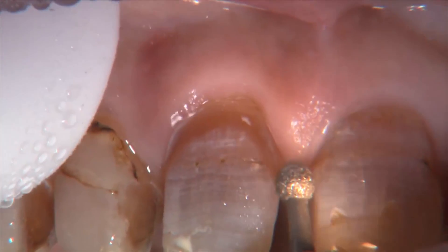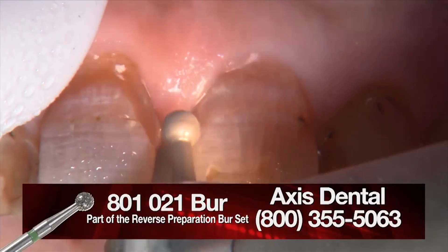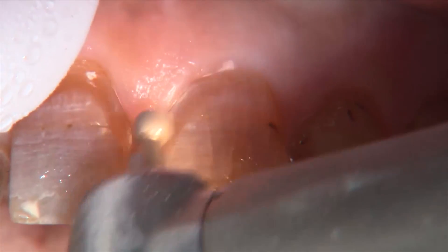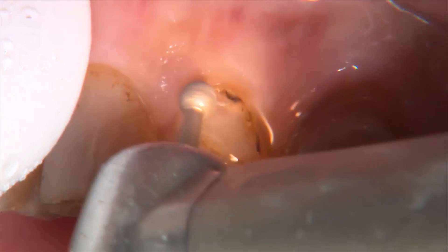Here's one of life's simple pleasures — cutting off a PFM. How wonderful that is compared to cutting off some of our new high-strength all-ceramic crowns, where it takes six burs and the better part of an hour. So that PFM falls right off, and now we're going to start prepping the gingival margin.